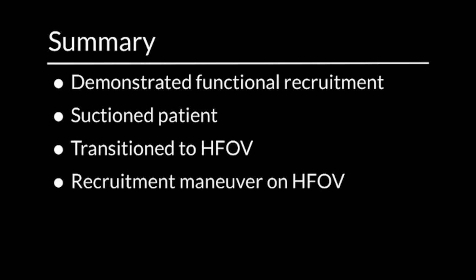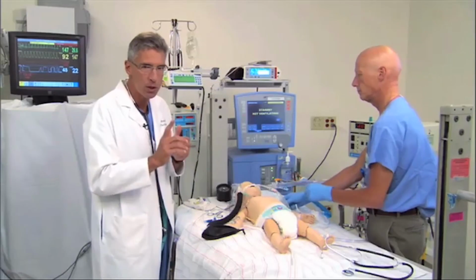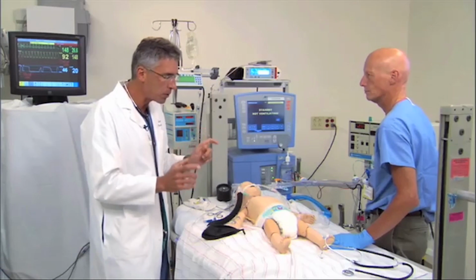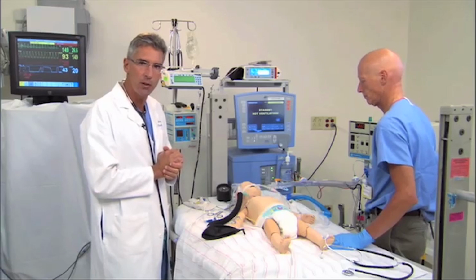We performed a recruitment maneuver on the oscillator, and in 10 minutes or less, we're now weaning the FiO2. So let me emphasize that it's a two-person operation. It takes 4 hands to do this safely, and it always helps to suction and manually ventilate the patient during this transition.